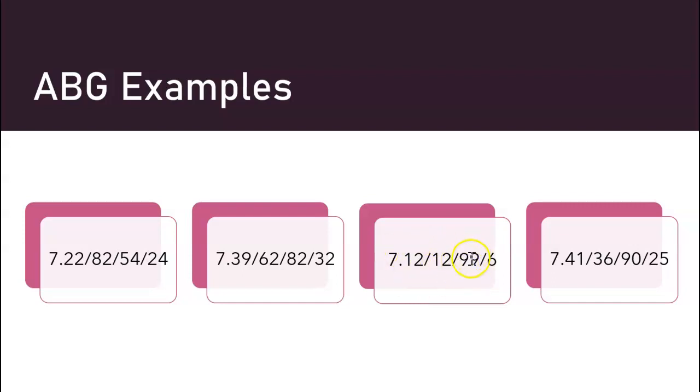And if this was low, you could give oxygen, but that's a beautiful PaO2. A lot of times it just takes insulin treatment and some other medications. But if you see a blood gas like this, a lot of times it's a metabolic condition. Just be aware, you might see blood gases like this. That's why I put it on here.